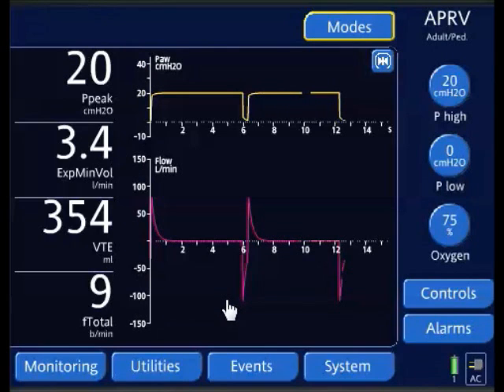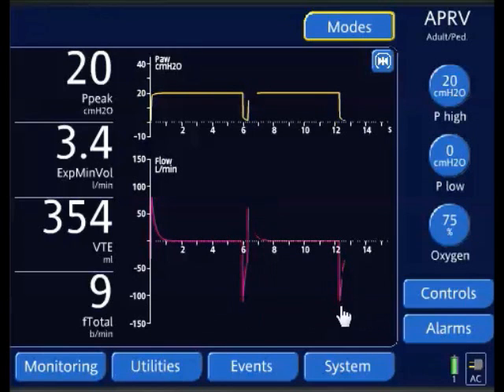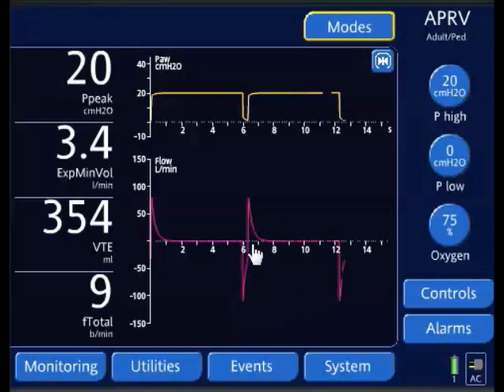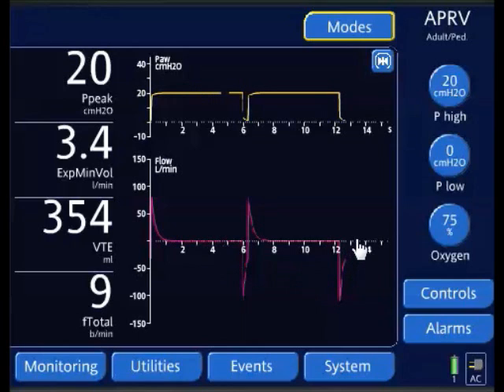If I do not know the expiratory time constant, I can just use waveform analysis. I will evaluate my flow waveform, which is here in purple, and look at my expiratory flow component. You can see it doesn't return to baseline. So if I'm meeting the four time constants, this flow should return all the way to baseline — and I know all my lung units are emptying when it gets to that zero-flow state.